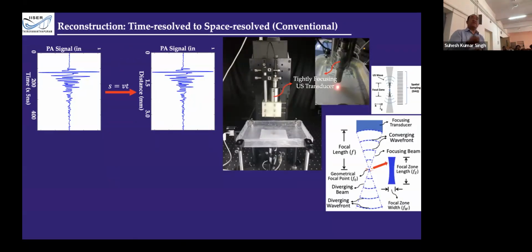One disadvantage of the presently available photoacoustic imaging system is that it uses a focusing ultrasound transducer. This time-resolved signal is the measurement at a particular time, and this measurement is averaged over the sectoral areas, that is the intersection of the focusing beam and the spherical wave generated from this point source. The obtainable resolution for this photoacoustic microscopy is controlled by this beam. As it is away from the focal spot size, the resolution is gone.